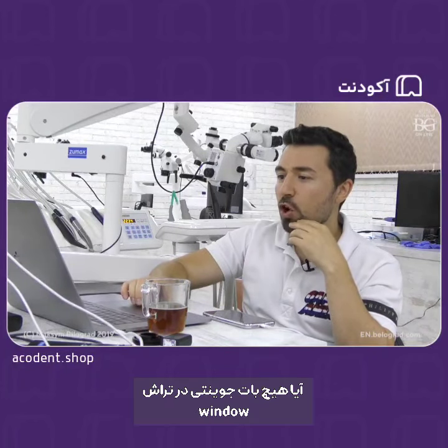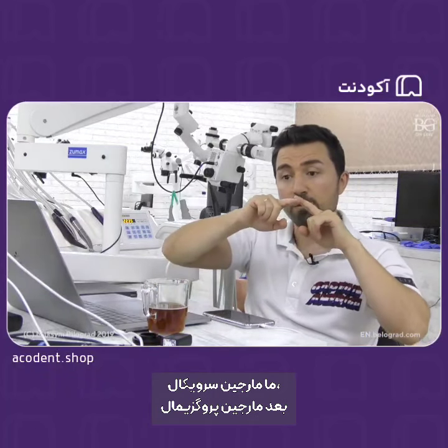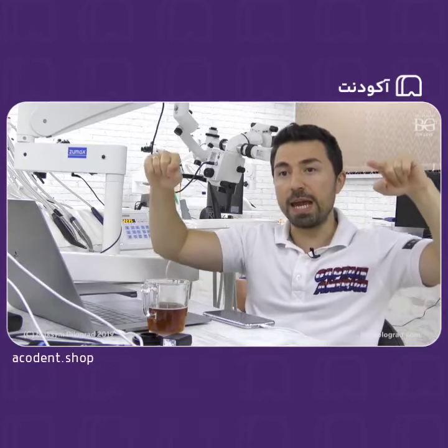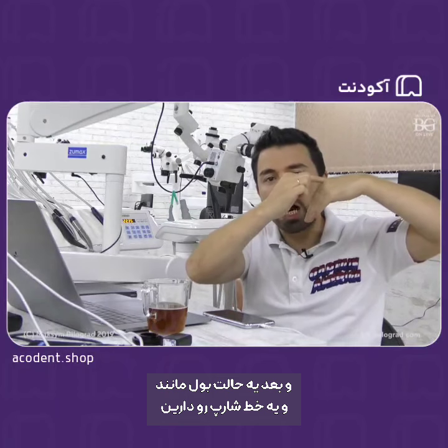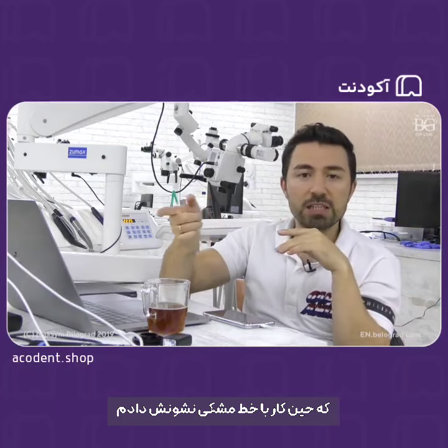Leonissima says there is no butt joint in window preparation, just proximal and buccal margin. Exactly, you just have, let's say, a cervical margin, then a proximal margin, and then you have this, how do you say, like a bevel, and you get this sharp line. Actually, I drew it in the online masterclass.